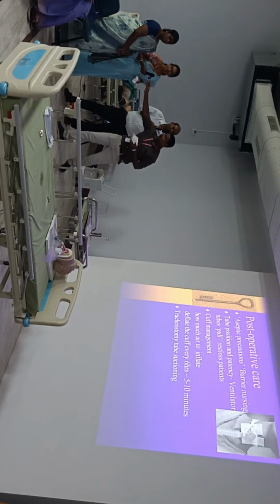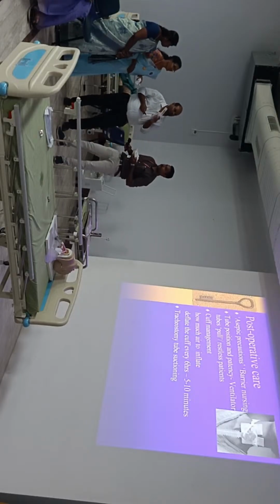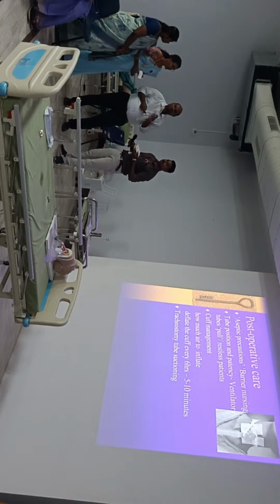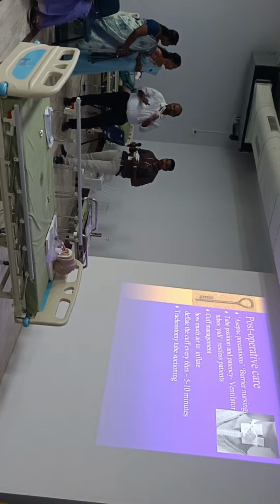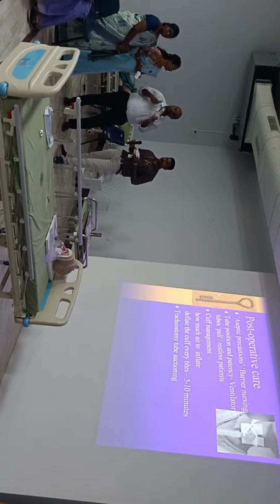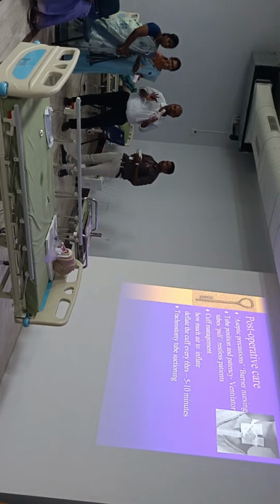No, somebody could say a wrong answer, but you want to learn it, right? We have seen people suctioning hourly also. We have seen people suctioning every 30 minutes also. We have seen people don't suction for 1 week also. That's why I'm just asking, how frequently do you think you have to suction?